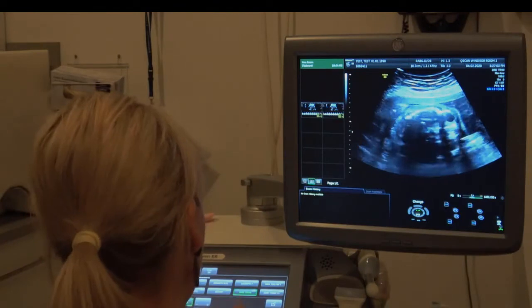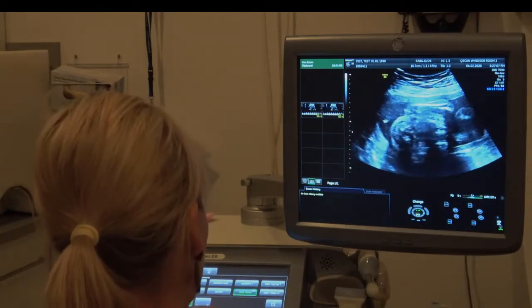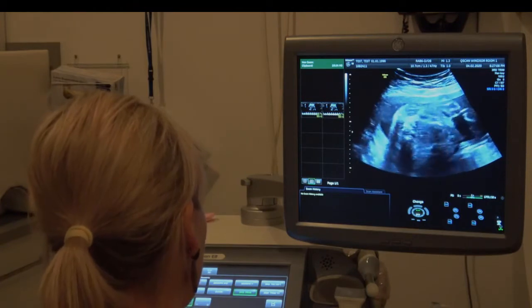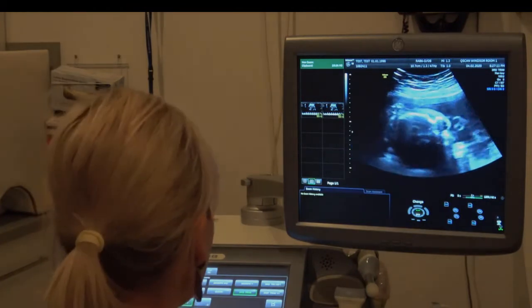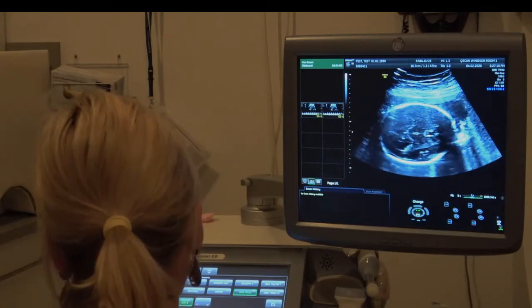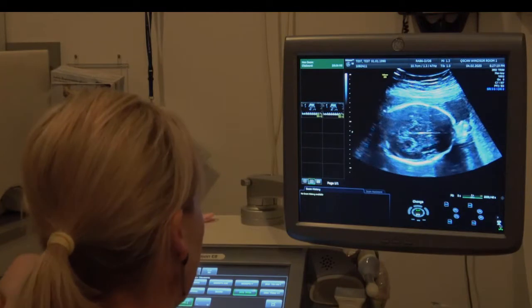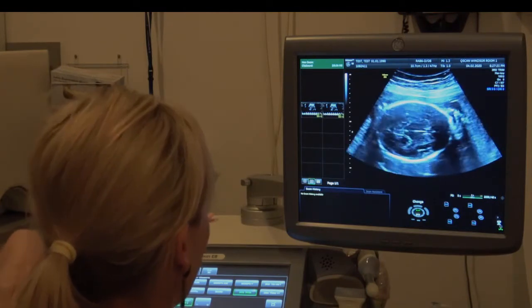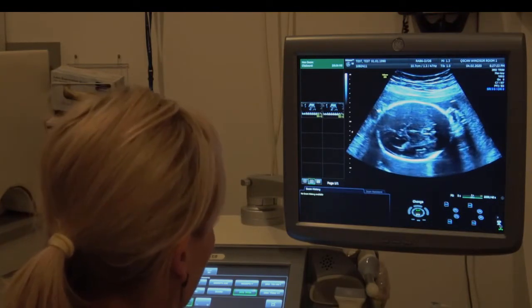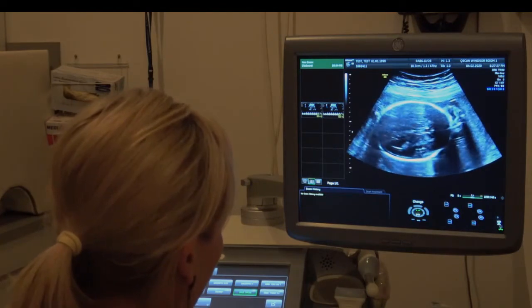So once I've got my MCA pulsatility index and I think, oh yeah, the waveform looks good, there's not too much end diastolic flow, it doesn't look like there's any sparing. There's a neat little trick that I wasn't aware of, that I got from Erica's presentation at the ASA. It probably pertains more to the peak systolic velocity when you're doing a baby that might have anemic changes.